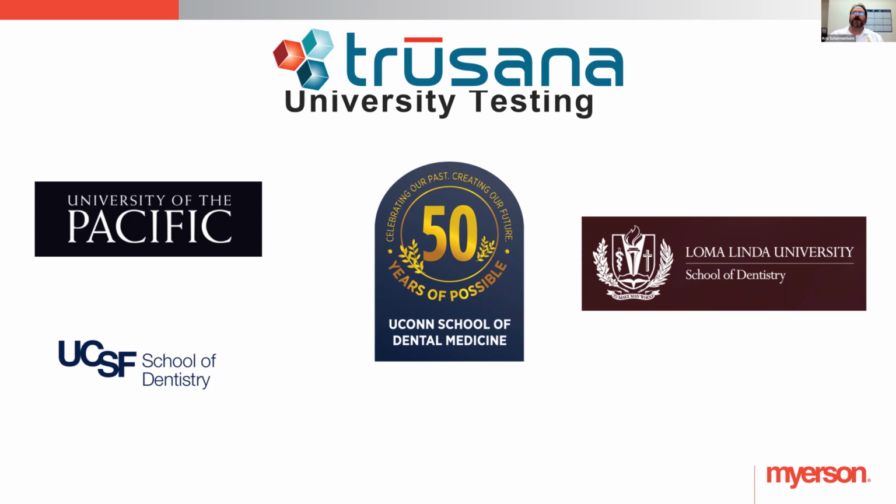The Trusana's holding up really nicely in that circumstance. But this is a really nice study that they're doing, because that is a really challenging appliance in our industry to make, because you're coming straight off the head of implants. It's as rigid as anything can be in the mouth. It's supporting a full arch.